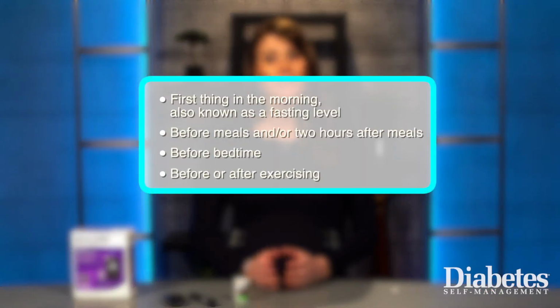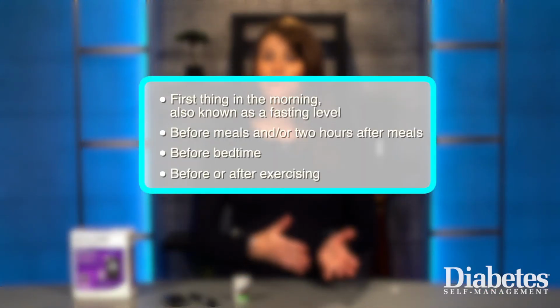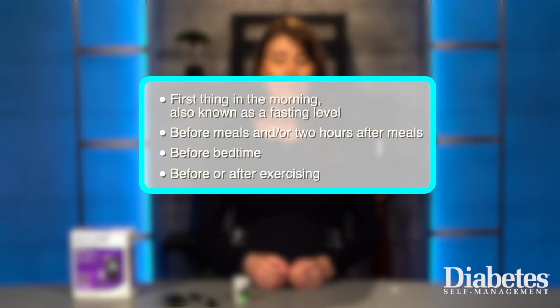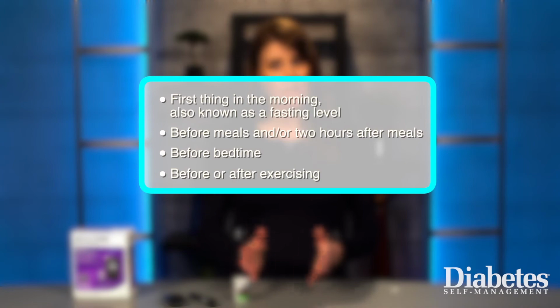Generally, how often you monitor your blood glucose will depend on your diabetes medication regimen. Your healthcare provider or certified diabetes educator can guide you as to the best times of day for you to monitor your blood glucose. The times of day that people typically monitor include first thing in the morning, also known as fasting level, before meals and/or 2 hours after meals, before bedtime, and before or after exercising.